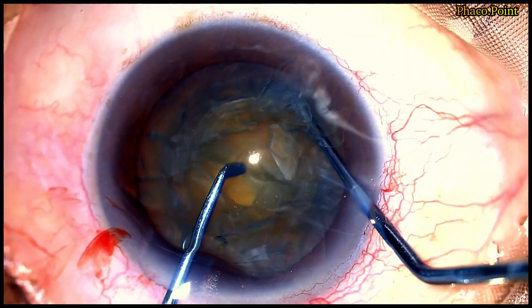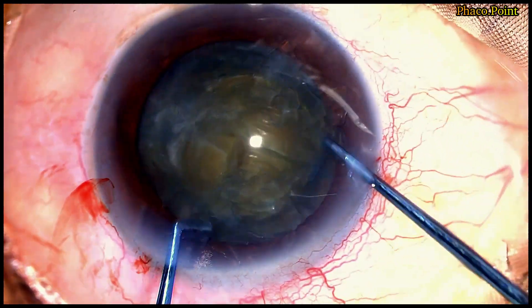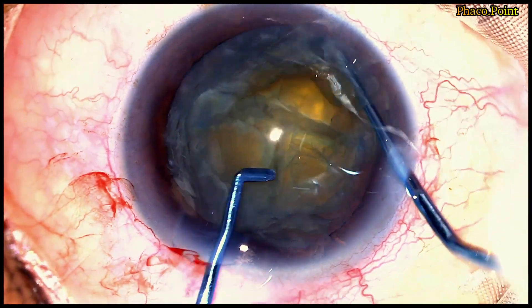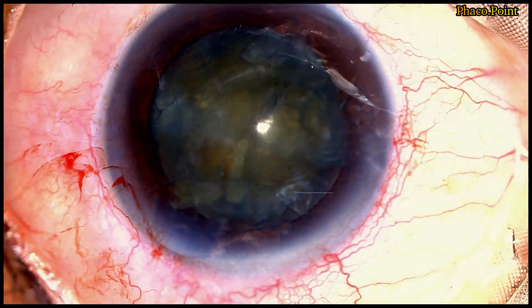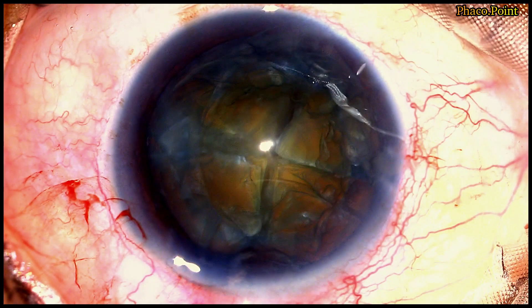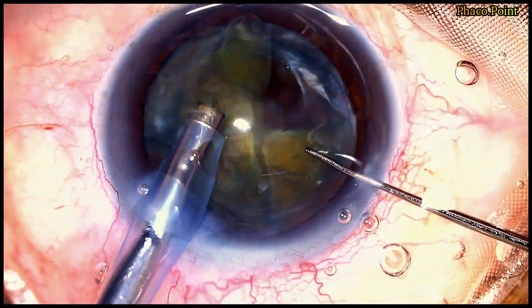Using the Mohanta pre-chopper, I have found a clean division, which is sometimes challenging in these very soft cataracts. The hooking of the nucleus or heminucleus should always be on the opposite side in order to facilitate a predictable, safe, and effective nucleus disassembly. You can see how the nucleus has been successfully divided into four almost uniform nuclear fragments, followed by the emulsification of each of the downsized fragments.